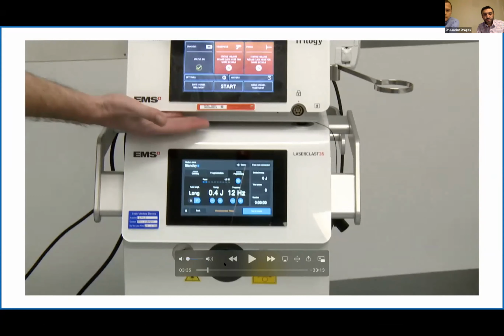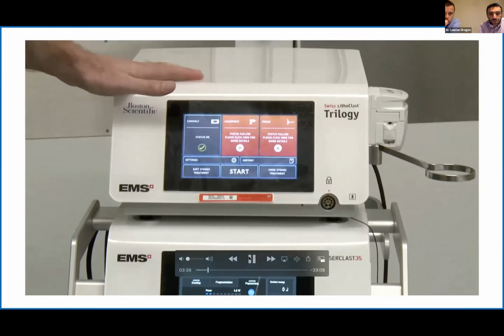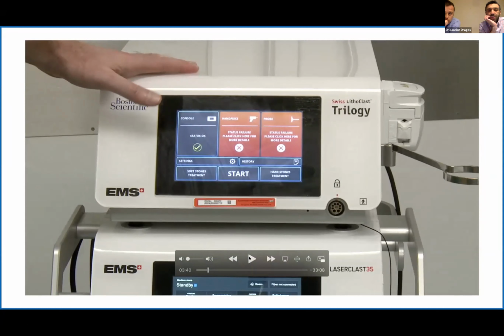I will give you a brief overview of Trilogy. For those of you who haven't used it, we acquired our own Trilogy machine about a year ago, and it really has changed the way we do things, and we have found more and more uses for it. The advantage of Trilogy is that it is a hollow single probe device, which allows you to combine ultrasound as well as ballistic energy and suction. Being a single probe device allows a bigger surface area, which means more suction, and also allows you to remove a larger fragment, therefore increasing efficiency during the procedure. And hopefully we'll be able to demonstrate some of these effects during the procedure.